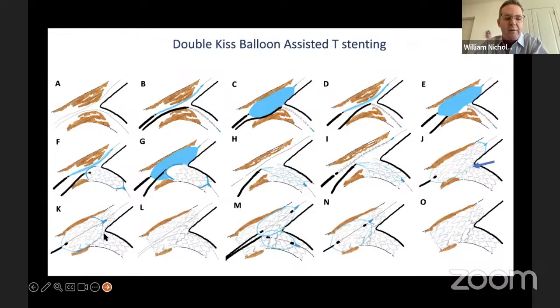But then you POT, and when you POT, do you think that at this point you produce a mini crush of the stent at the side branch? I think it has to do with how much you've hung out. I think if you've done your TAP nicely, you concertina the stent back up. You almost accordion it back up rather than fold it over the lumen, so you don't actually have a real mini crush. I think if you have more stent than you desired, you invariably do create, exactly like you said, a mini crush scenario.